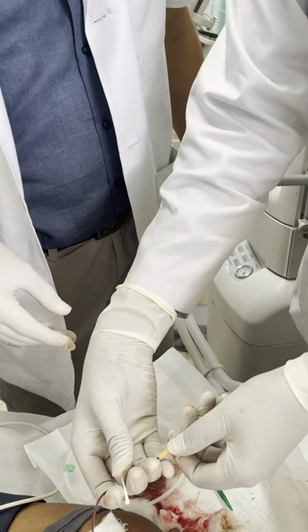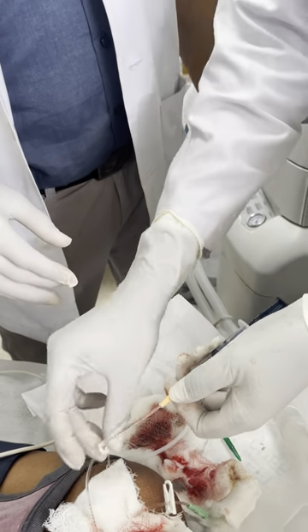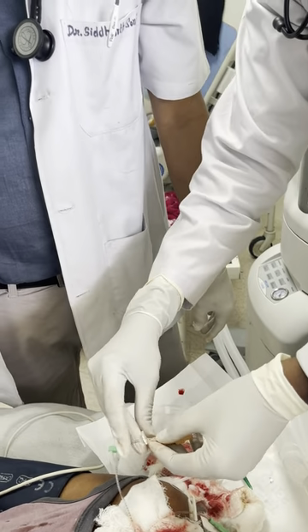Terminal. Good enough. Very nice. Lock both the ends and put these caps.